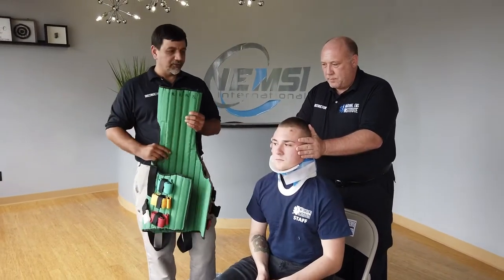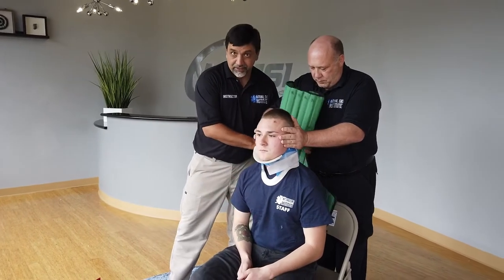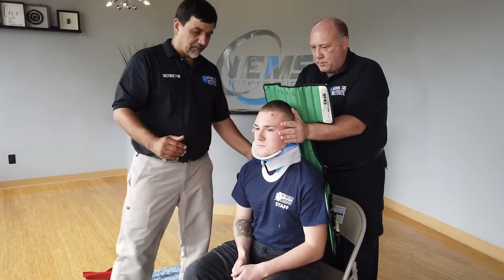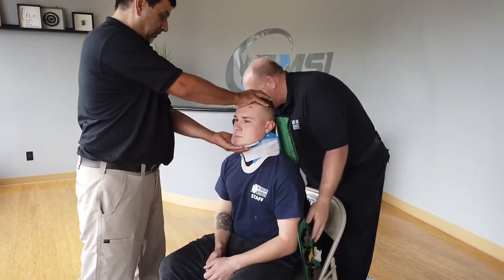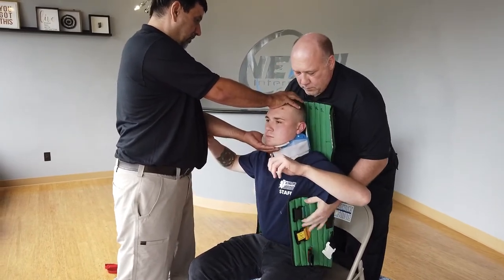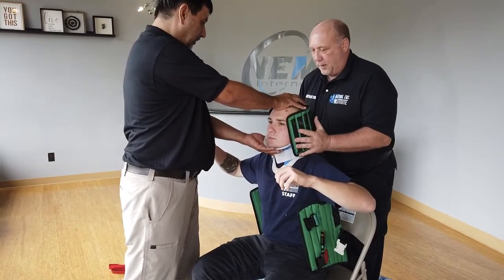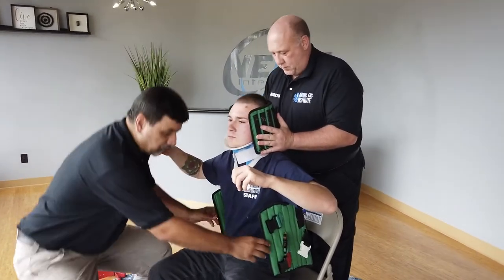At this time we are going to insert the KED between the patient and the back of the vehicle, setting it on my partner's hands. I am going to come over to the front of my patient. I am going to take c-spine while my partner puts the device in place. Can you lift your hands please? My partner will then take over c-spine.